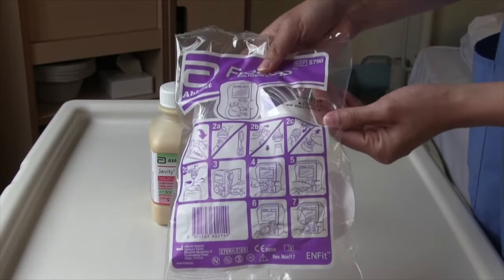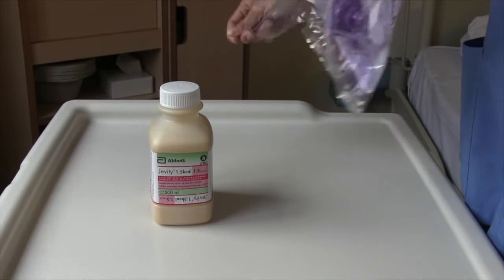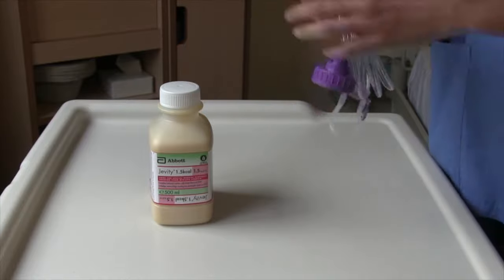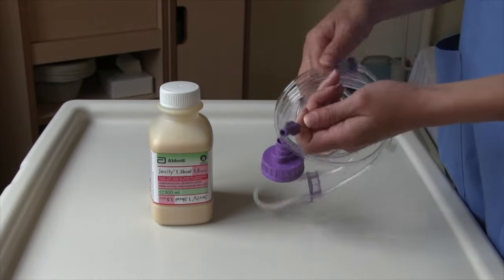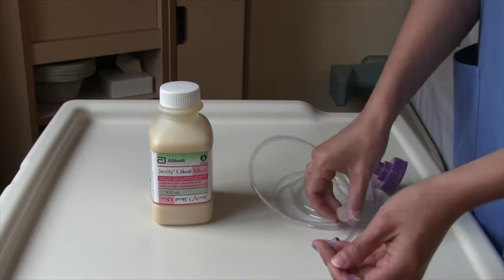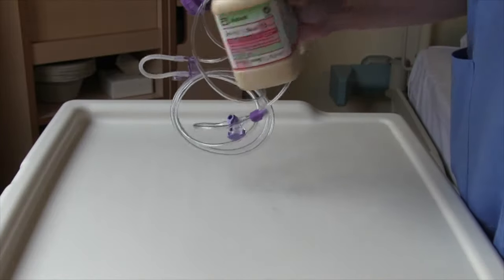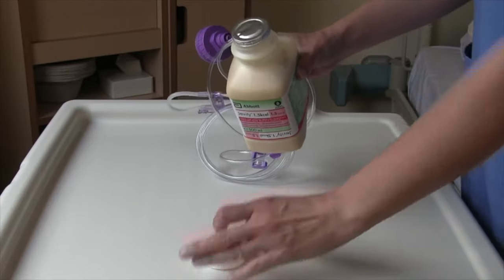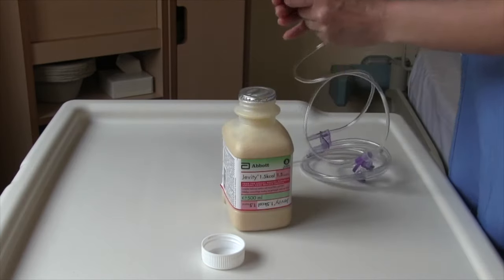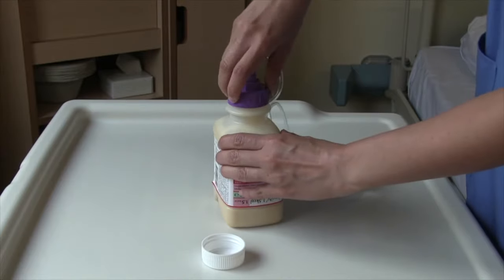Take your giving set package and check the expiry date to ensure the package is within date. Open the package and take off the paper strip. Ensure the end of the tube is not touching any surrounding surfaces to avoid contamination. There is a cap provided that is attached to your tube that you can place over the end. Take the protective cap off the bottle. There is a seal in place — do not puncture the seal with your hands or any objects. Screw the giving set onto the feed and this will automatically break the seal.